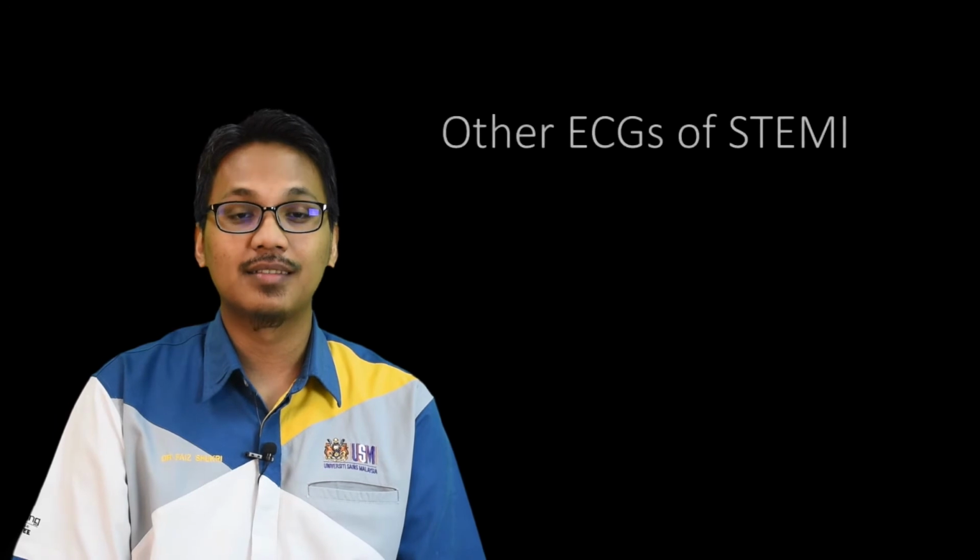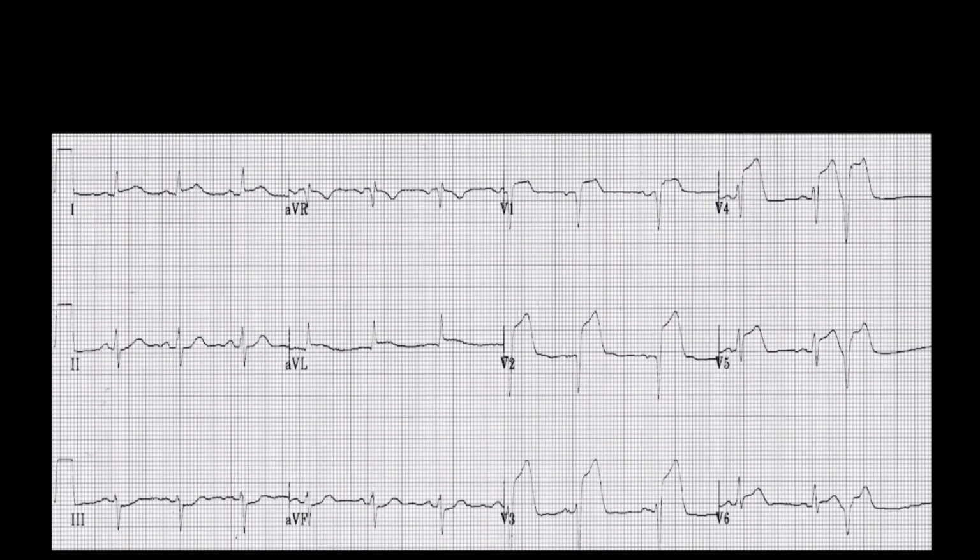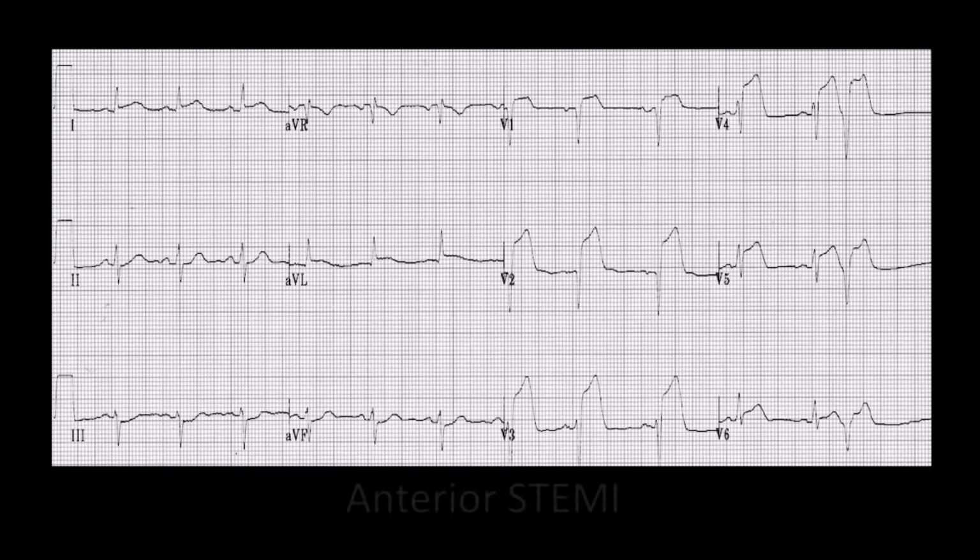So what are examples of other ECGs in acute myocardial infarction and also STEMI? So this is the example of ECG in anterior STEMI. As you can see, we can see obvious ST elevation from lead V1 until V6. And there is also ST depression, what we call as a reciprocal ST depression at inferior leads, which are our lead 2, 3, and also AVF.